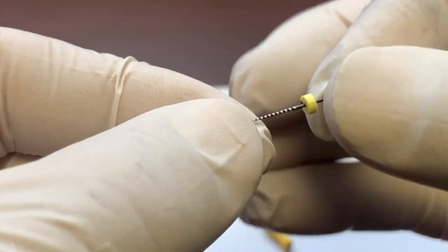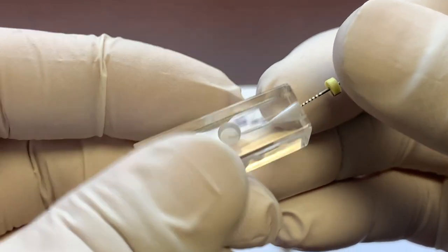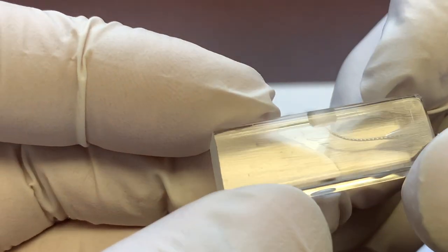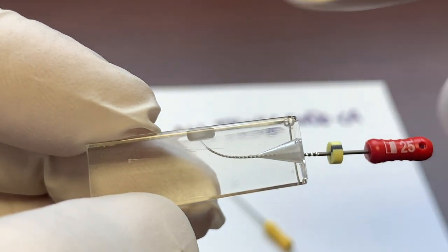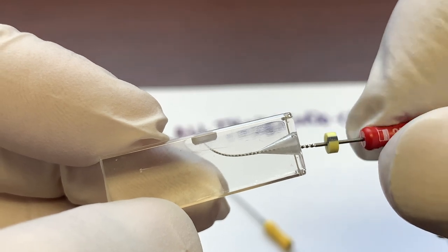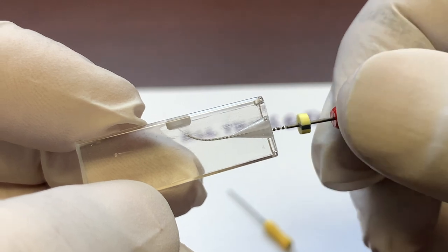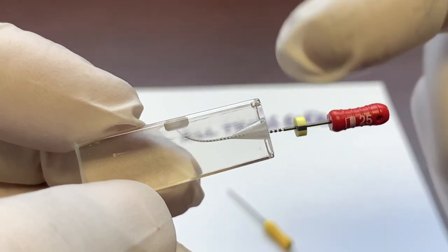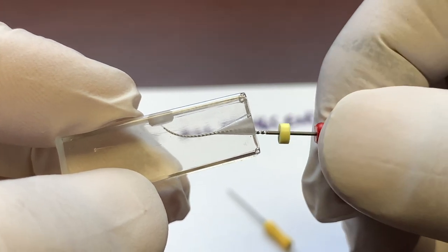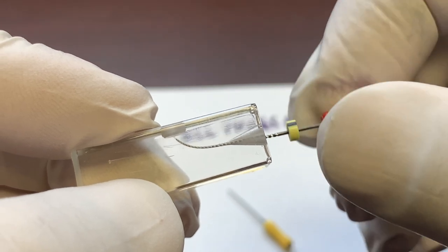Pretty cool, eh? So that's the balanced force technique. You can see how that file is going around the curve. I'm not hand filing. I'm not doing any up and down. I'm not doing watch winding. I'm literally doing a balanced force technique. So it's the quarter turn in and a full turn in reverse, counterclockwise, with apical pressure. Now, if you quarter turn in and your file comes back out, that means that you're not placing enough apical pressure, okay?